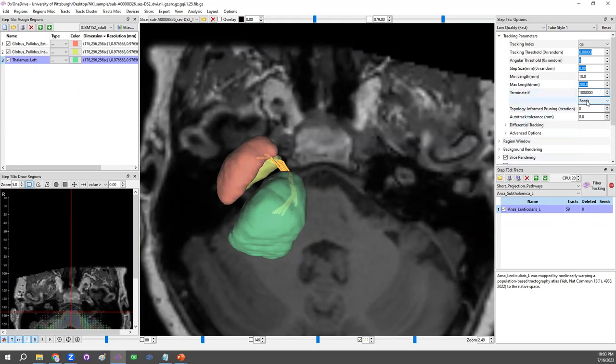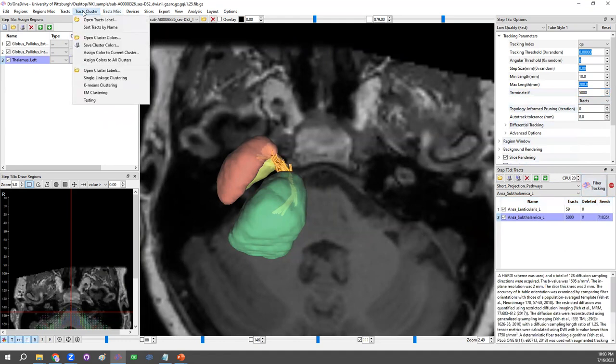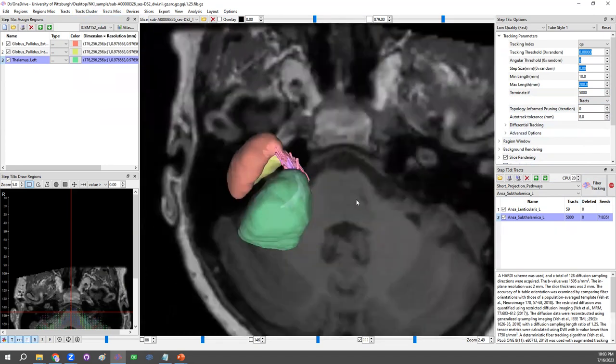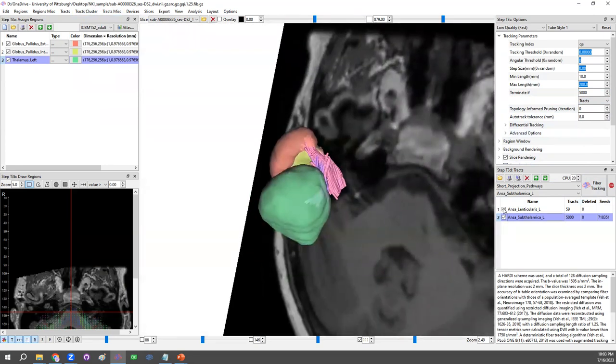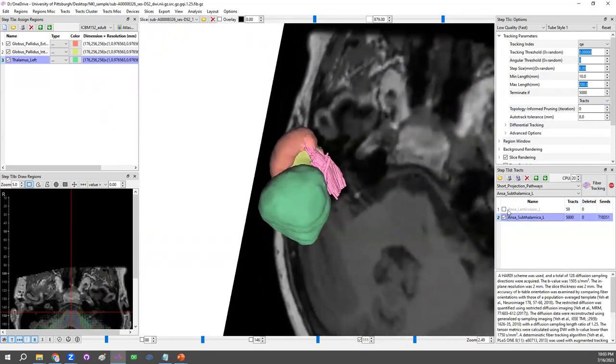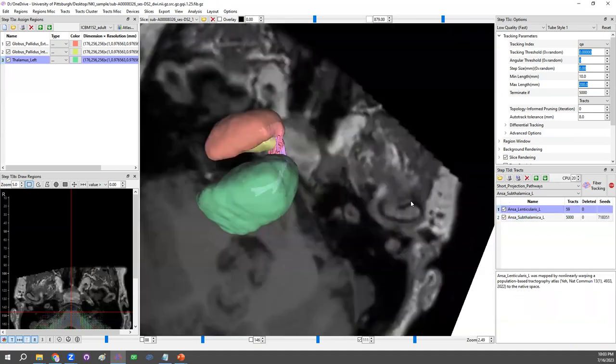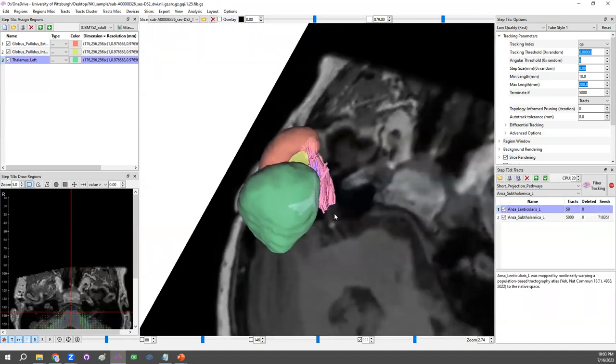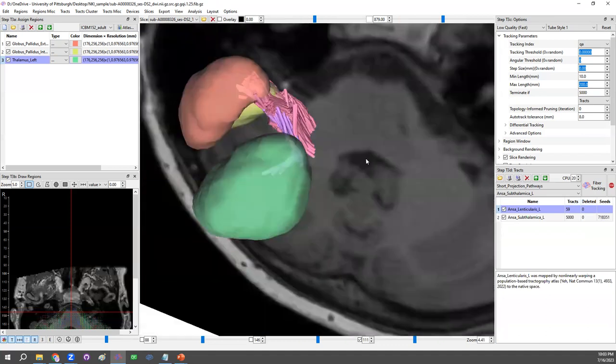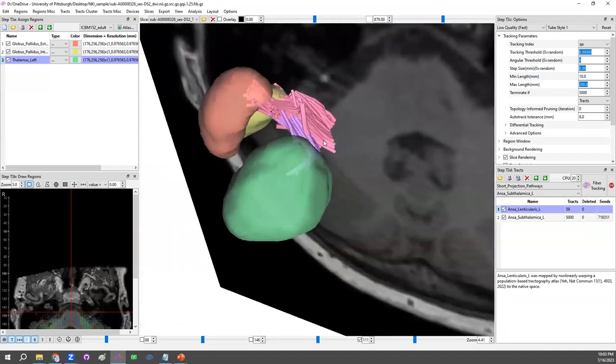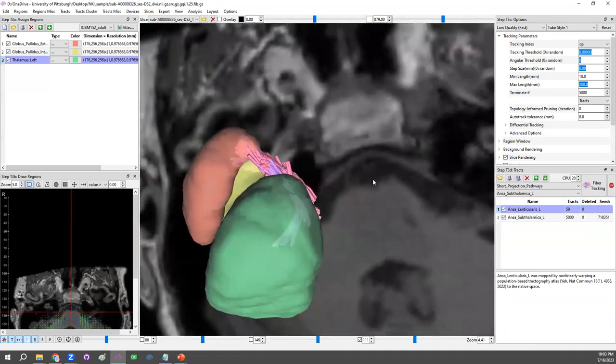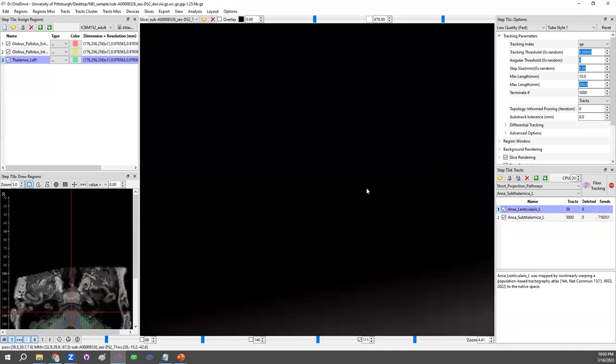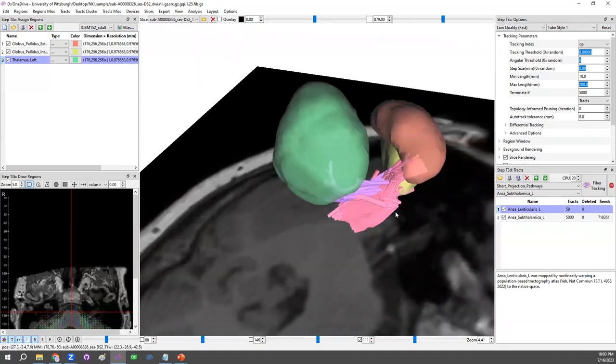This pruning step would remove noisy pathway but short pathway map works very well. Also, the tolerance. So this parameter controls the individual difference that would be included in this mapping. For this small pathway, usually we don't need a large value. Maybe we're here, we could reduce to 8. And then here, instead of placing seeds, we could say, well, just want to map 5,000 tracks and run fiber tracking. And here, let me assign different color. So if you see, one is individual mapping. Another one is group average. There could be some difference. But here, we could use this interface to see how that looks like in DSI Studio.